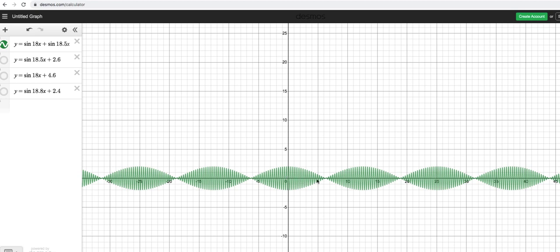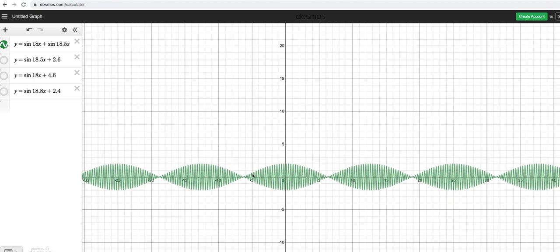You can also see this similar pattern in beta frequencies. When an EEG has a lot of beta activity, sometimes you see a pattern that appears like these kind of spindles. So what really does this mean? This is what I will basically try to explain in this brief tutorial.